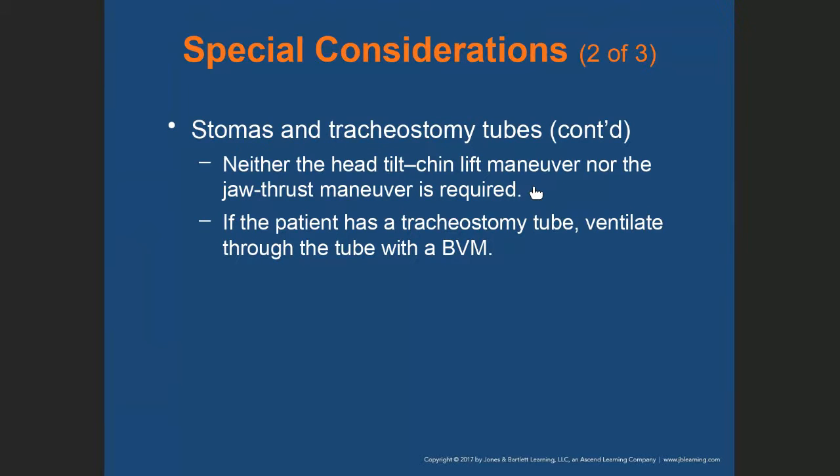If you're going to suction the tracheostomy, it has to be a sterile technique, so you must use sterile gloves, and you're going to be using a flexible suction catheter. If the patient has a tracheostomy tube, ventilate through the tube with a BVM.